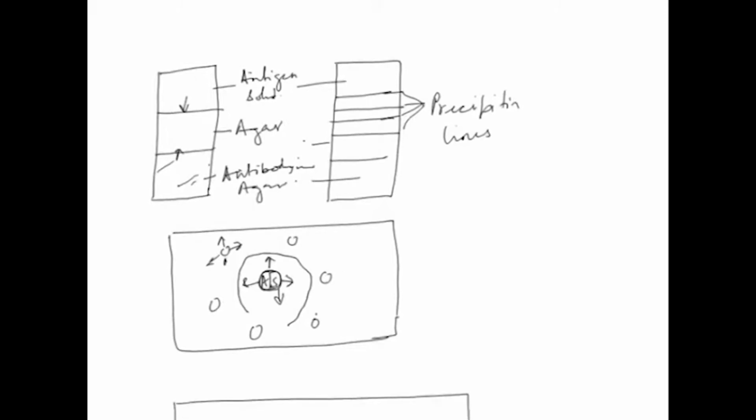Now, everything is the same: you have a microscopic plate, and you have agar containing things. To see this particular phenomenon, that is, reaction of identity, like I said, here it is antigen and there it is antibody, that is anti AB. Now, see here both have the same antigenic determinants, AB AB. So, what will happen?